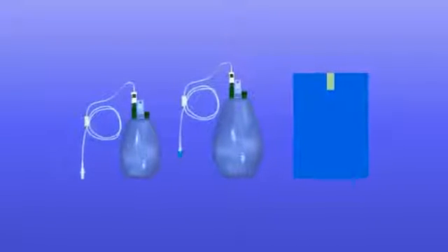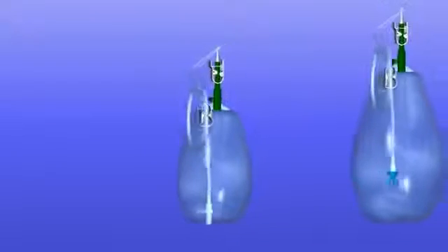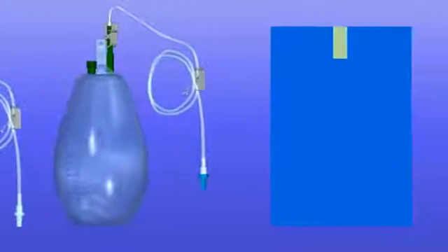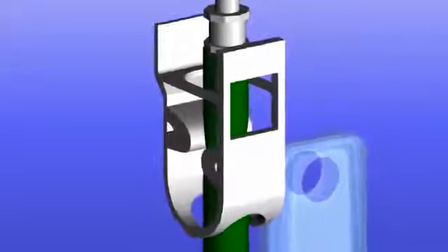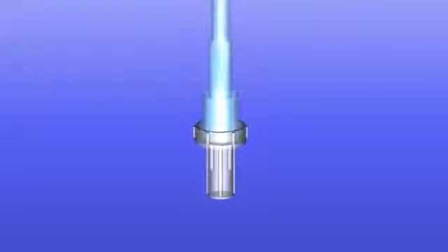The ASEPT Drainage Kit comes with all the items you need to drain fluid from your drainage catheter. The ASEPT Drainage Kit either comes with a single 600 milliliter or 1000 milliliter drainage bottle and a procedure pack that contains all the dressing change items. The ASEPT drainage bottle contains a vacuum. The bottle kit comes with a green vacuum indicator plastic cap on each bottle, the drain line consisting of clear plastic tubing with pinch clamp, a green tube with a pinch clamp, the connector on the end of the drain line with a protective cap.